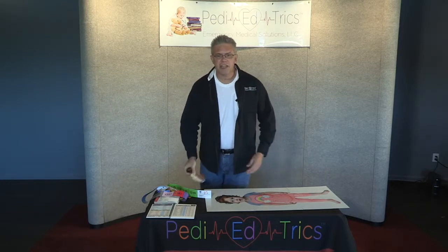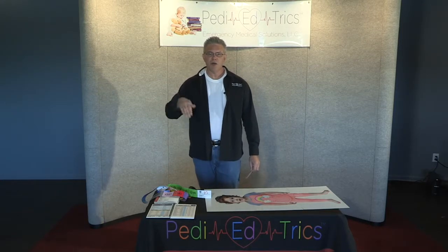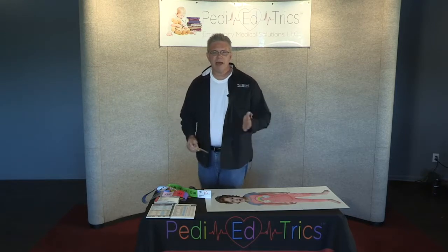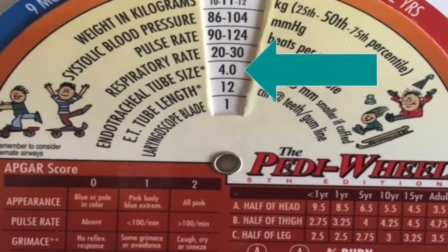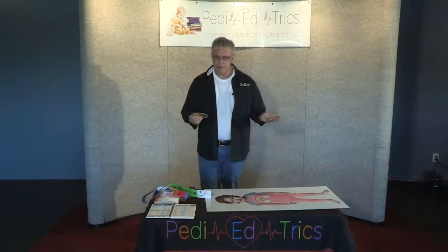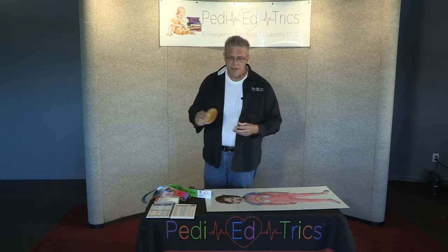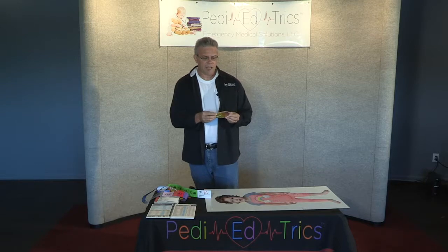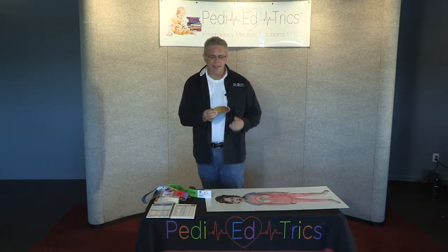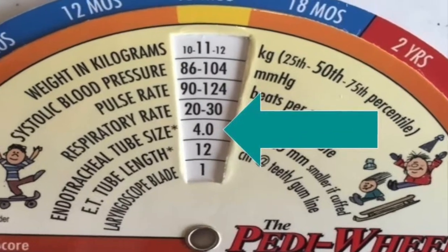Now, other options, we've got cheat sheets. And when it comes to cheat sheets, my personal recommendation that I really like, because it again has no batteries, no Wi-Fi, is blood and bodily fluid resistant, and it fits in your pocket, is the Pedi wheel. And the Pedi wheel comes included as part of Scenarios in Seconds. And if you take the Pedi wheel, remember you have age on one side and weight on the other. So when it comes to age, this is a 14-month-old, so we would simply go ahead, in our case, dial in 15 months, because it's remarkably close to 14 months. And when we dial it in, it says that a 14-month-old kid should get a 4-tube.